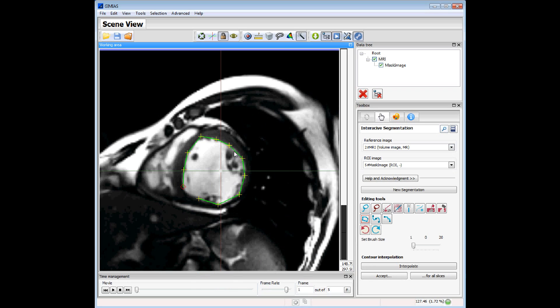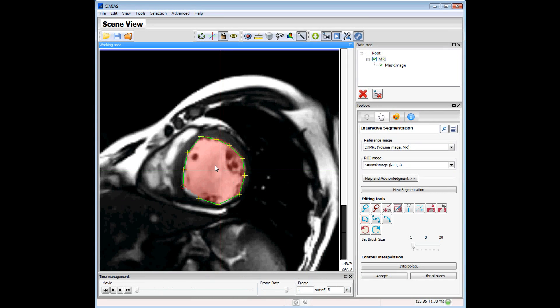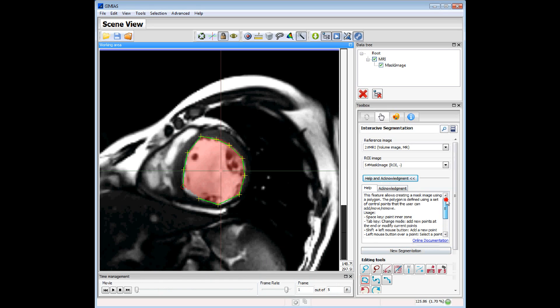Once we have defined all the control points we can press the Space key and we paint the inner zone. We can see all the keys used by this tool. The Space key is to paint the inner zone. The Shift and left mouse button is to add a new point.